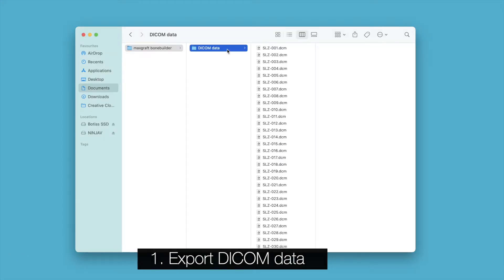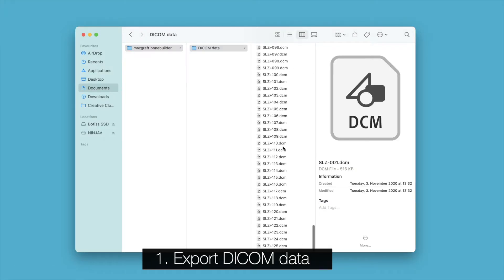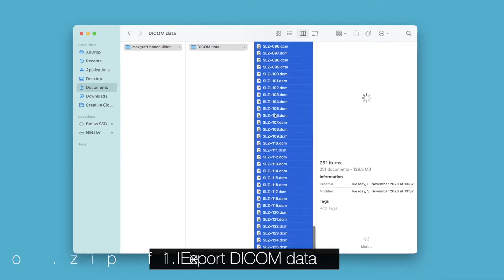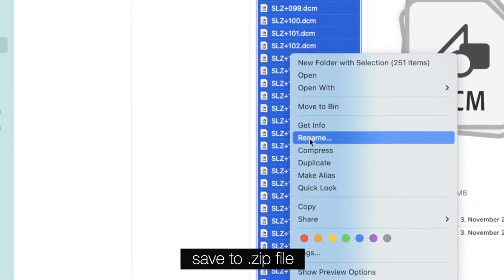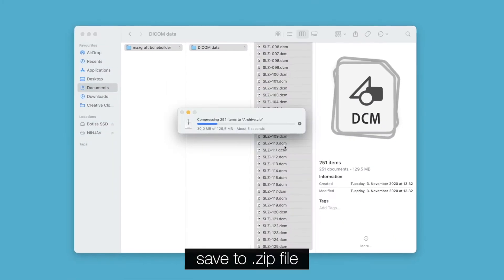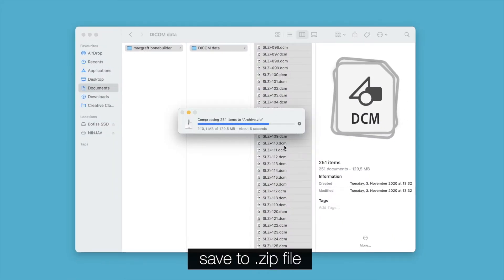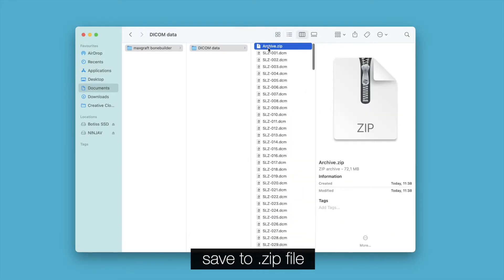Please export your patient data in DICOM DCM format and then save all files into a zip file.